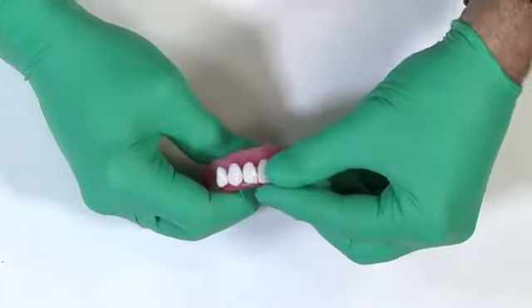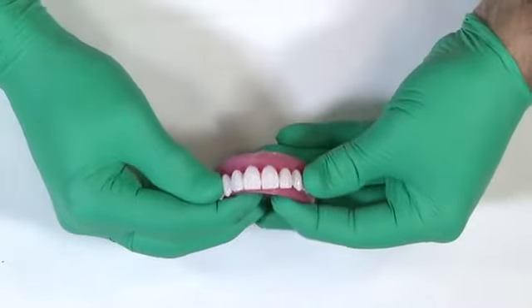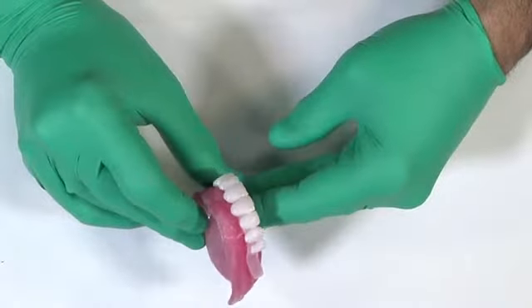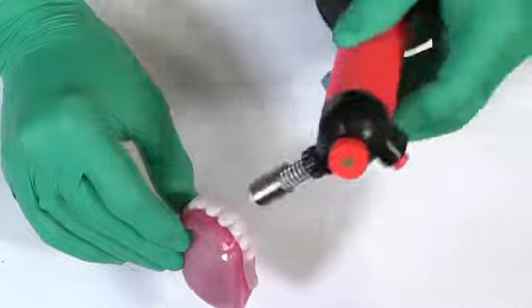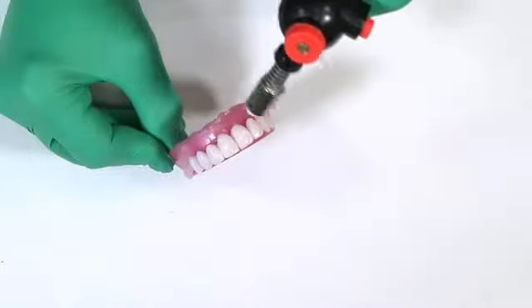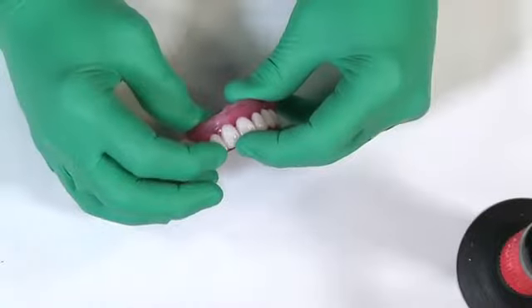Then place them on the wax rim and align the incisal edges with the plane of occlusion. You may use a mini torch to further refine the arrangement. Here, Dr. Masad is moving some teeth to form a slightly more accentuated feminine occlusal plane.